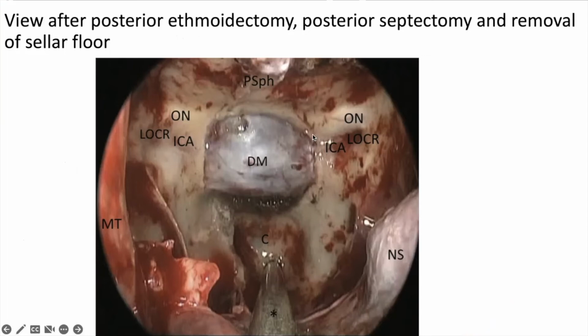For blues, you should be able to find, after bone removal, the cavernous sinus on either side, the anterior intercavernous sinus, and the posterior intercavernous sinus. So all four blues, this much bone you should remove for pituitary lesions usually. You might have to extend bone removal anteriorly or posteriorly or even laterally in the extended approach, which we will not discuss in this particular lecture.